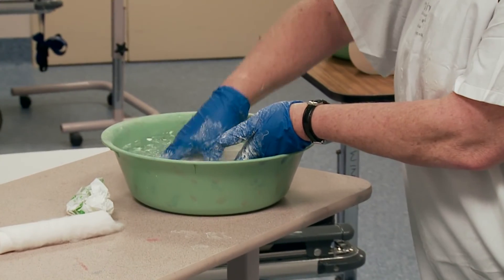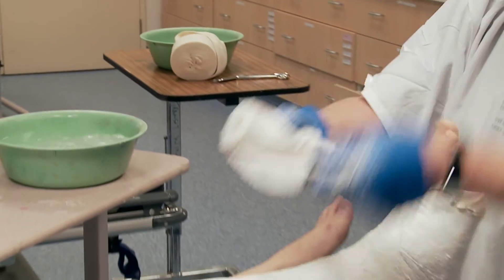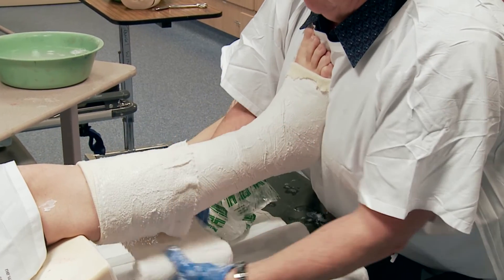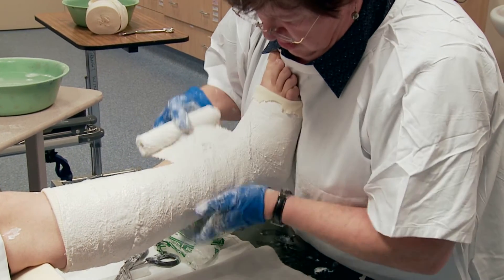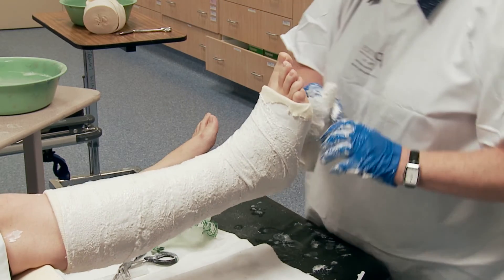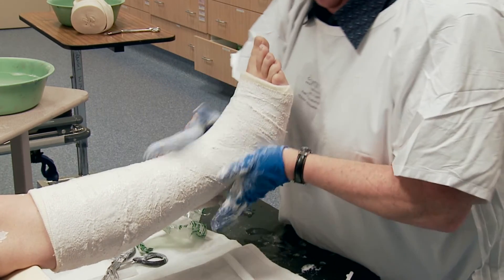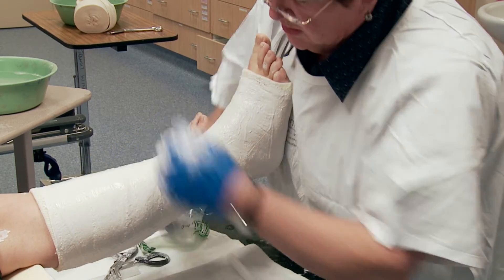Wait for the bubbles to come out of the water, then give it a gentle squeeze. Always hold the end, because if you put it in the water and you haven't got the end, you lose it and can't find it. Start off at this end — again you can use your shoulder, push it on. It's just up and drop. Around. Make it look nice. Caress it — always in a circular motion, never up and down.